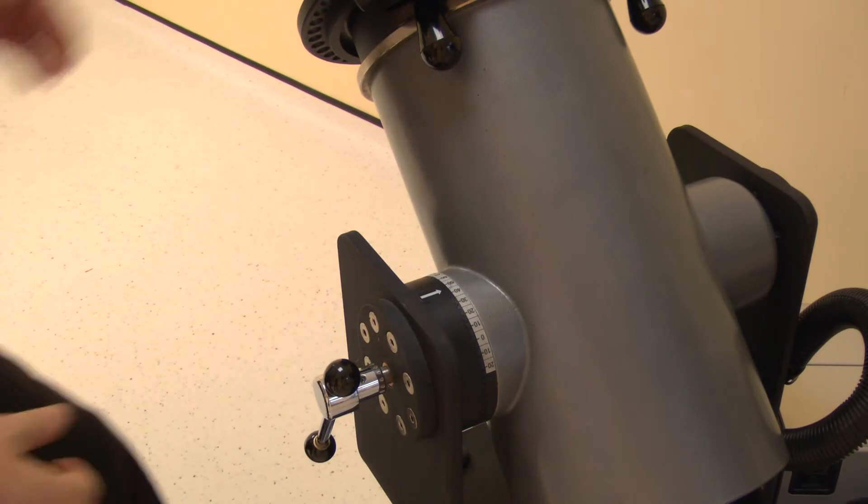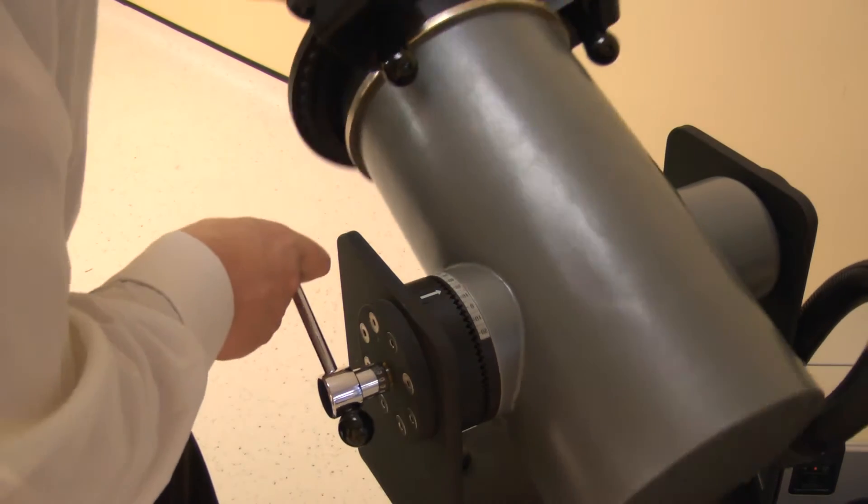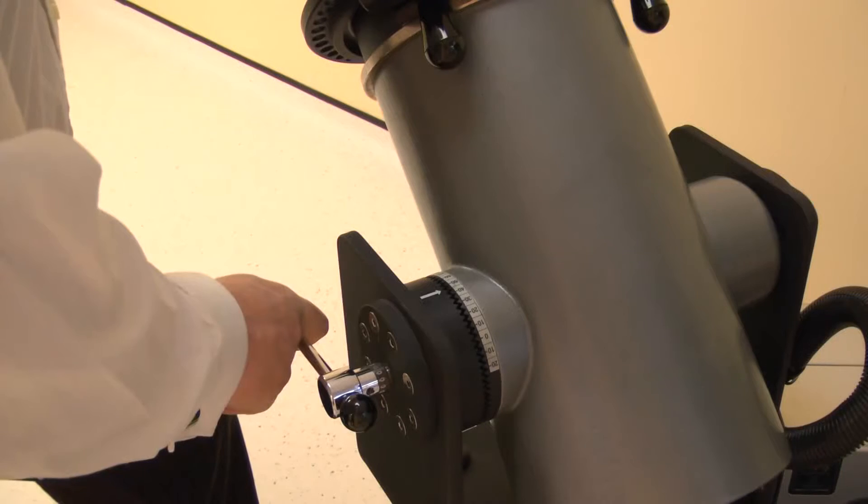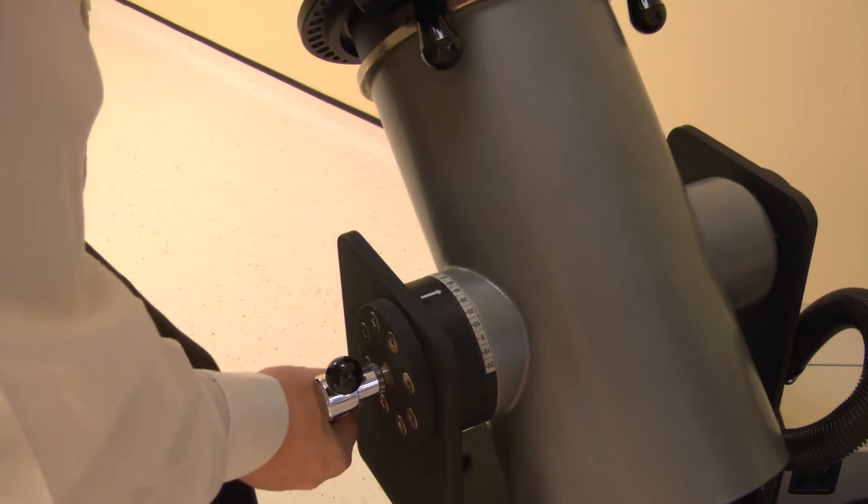Now set the dynamometer tilt. Release the locking handle then change, and adjust the tilt angle to 30 degrees. Lock by tightening the handle.